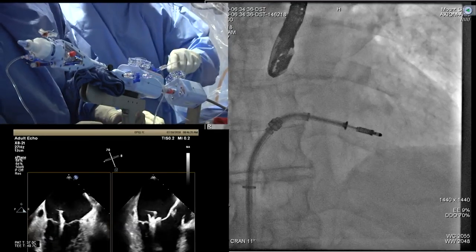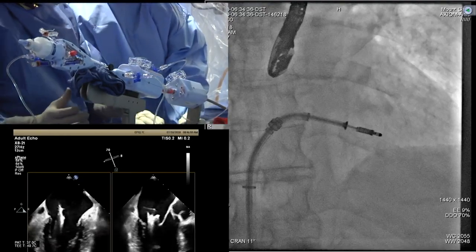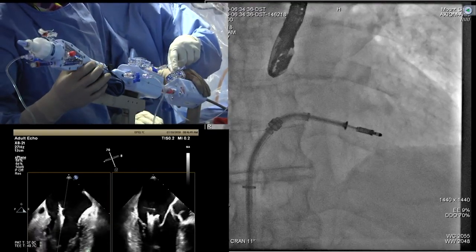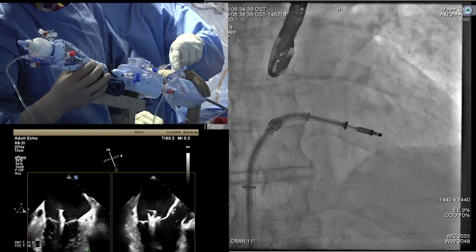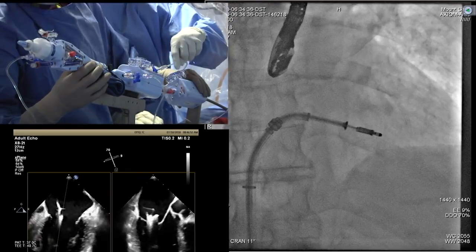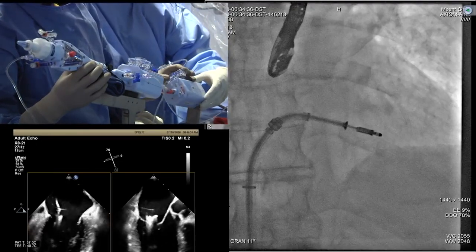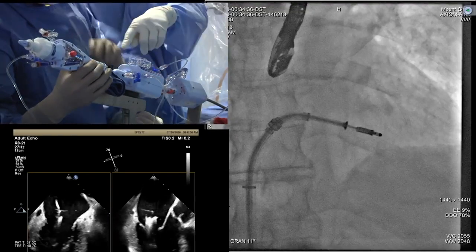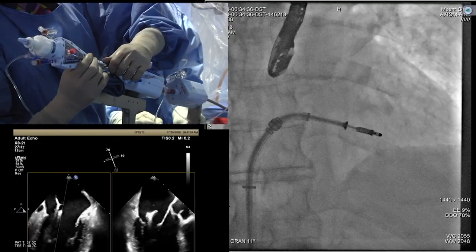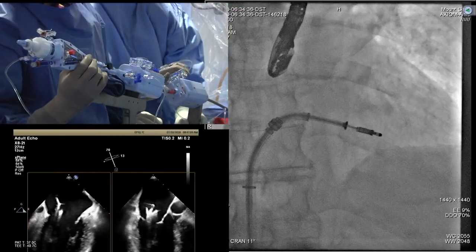So now we are saying we are not happy with the trajectory, right? Yeah, on the echo the trajectory doesn't look good. What do you think, Gila? You're right in the center. So you can try. Should we just go in and check? Plus. Okay, we are going a little plus. 3.5, 15. So the clip is too close, so we are pulling back the clip a little bit up. See that? That's good. And again, tighten your black knob, and then we are going a little plus.